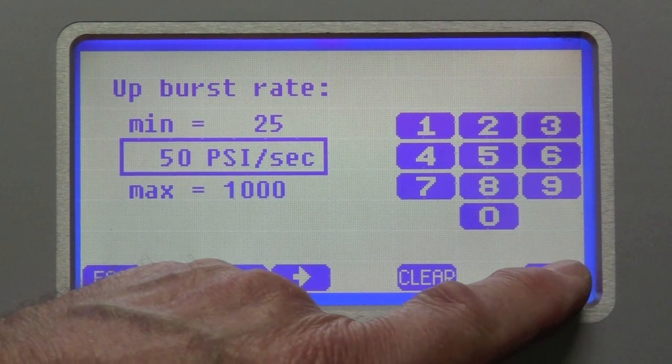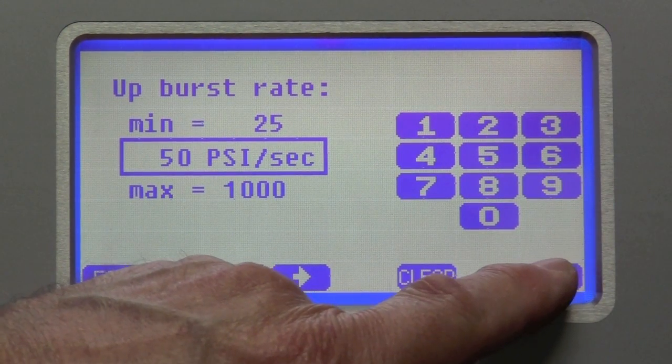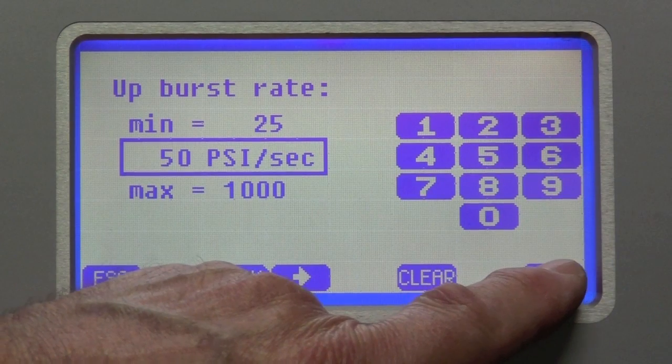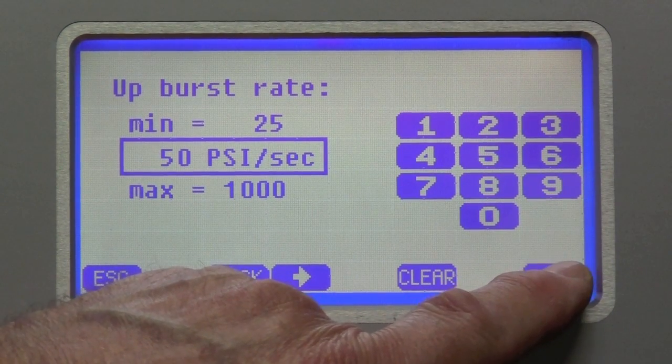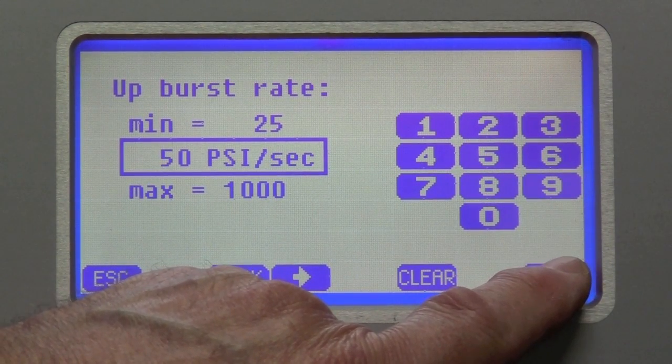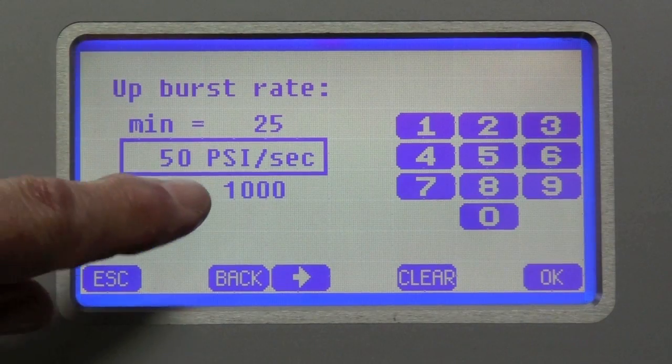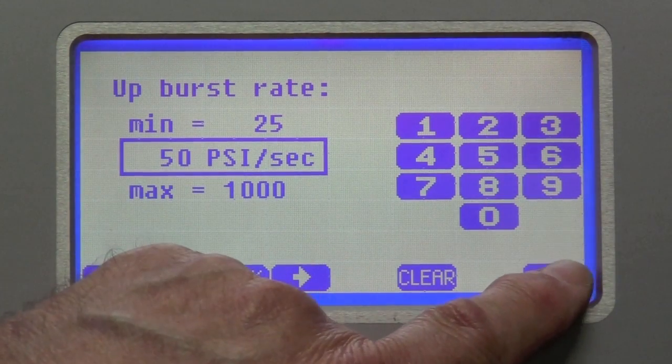The upburst rate is the sensitivity of the burst detection profile. And I'm going to leave it defaulted at 50 psi per second. And you can see the range, by the way, the minimum and the maximum on all of these parameters.